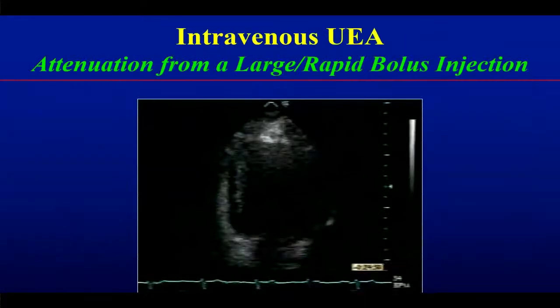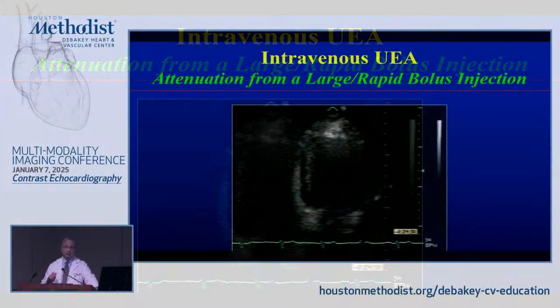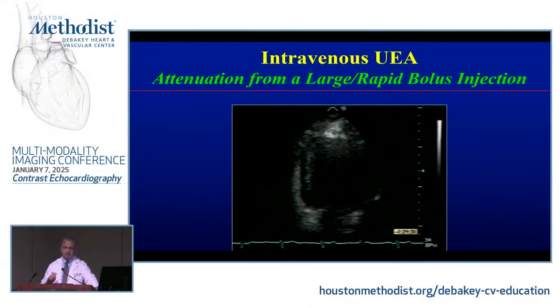Interestingly enough, these agents now also interact with your ultrasound beam and the properties of the ultrasound that you send. Remember from the first lectures that we had, and if you're online, we've talked about the basics of ultrasound, you send packets of high frequency sound, and this packet is going to interact with the bubbles themselves, and they're going to reflect ultrasound back.